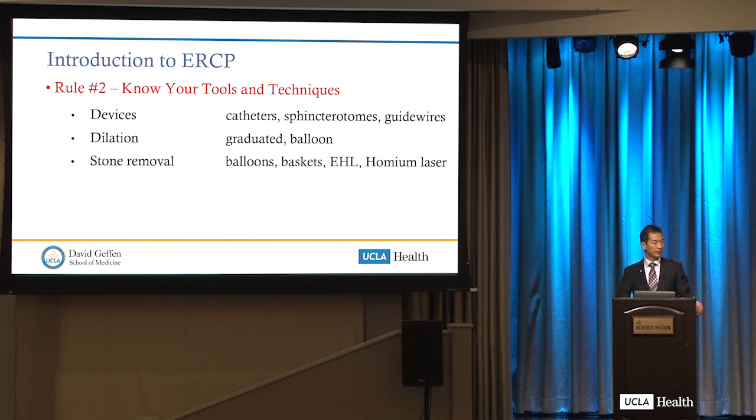For stone removal, there are a bunch of different techniques, and Dr. Issa will talk about this in a subsequent talk: balloons, baskets, EHL, holmium laser. Understand your different cannulation techniques and your comfort level with each of these techniques.